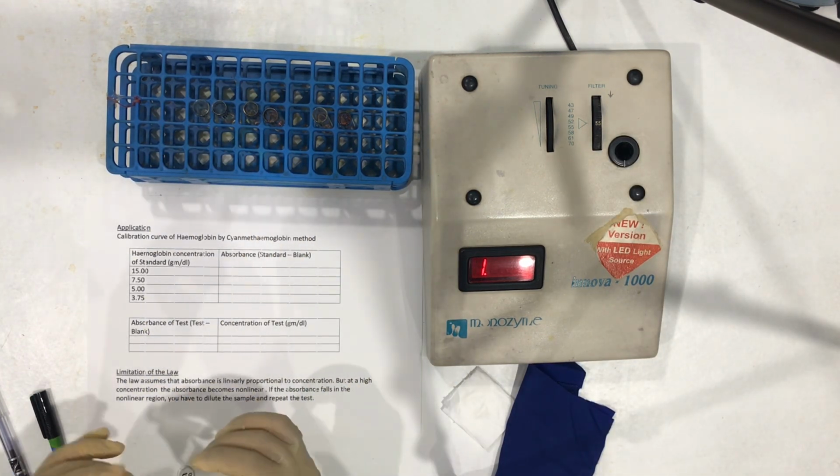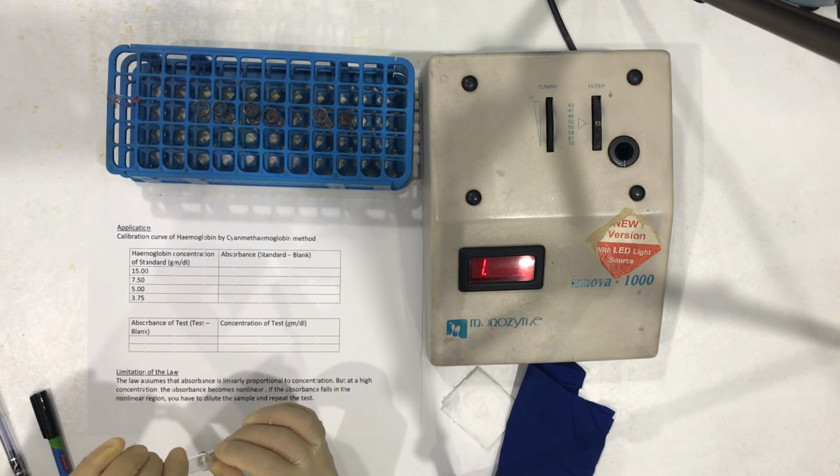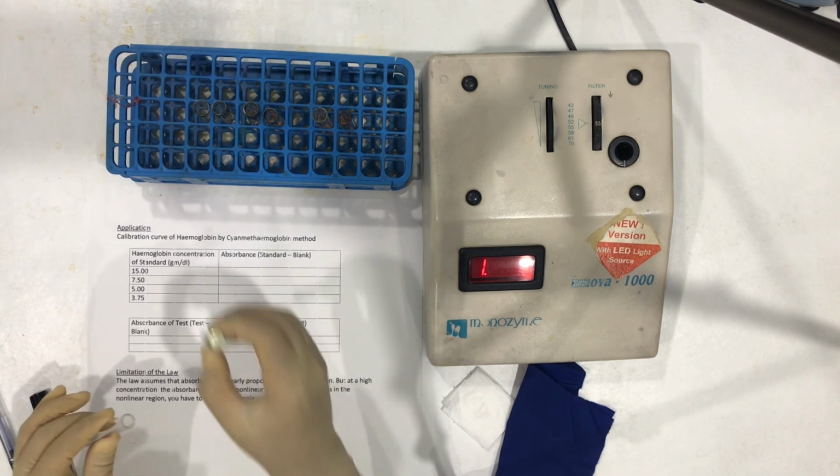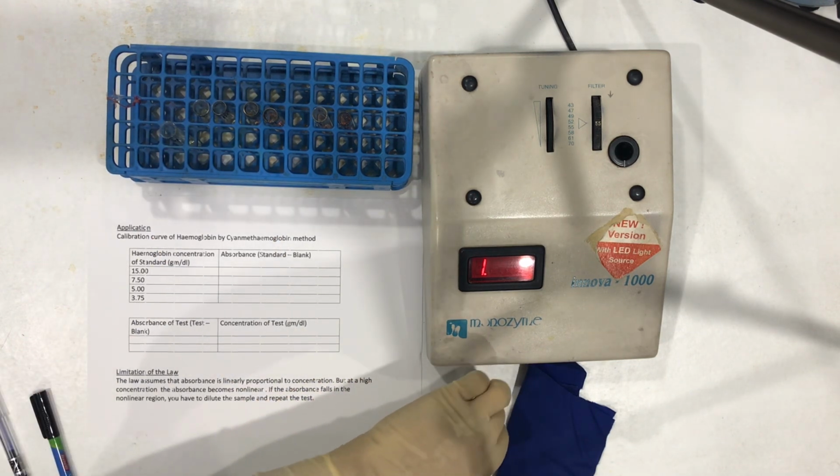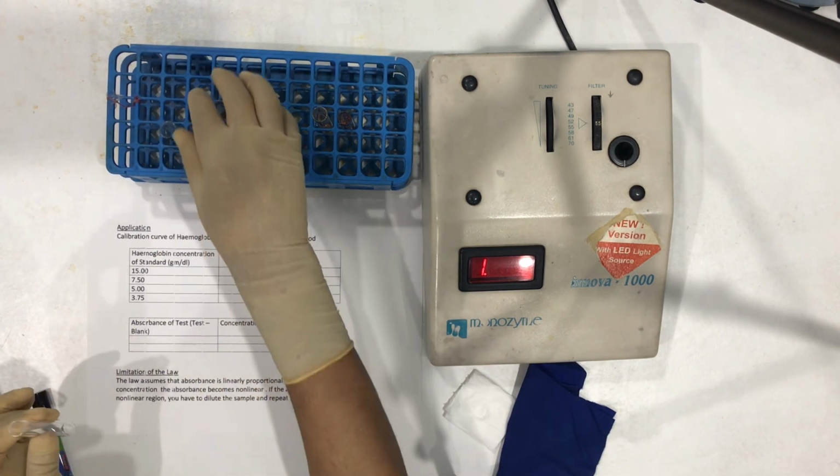So let us see the absorbance of our first standard, that is 3.75.